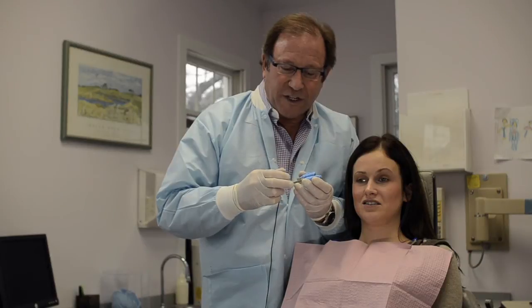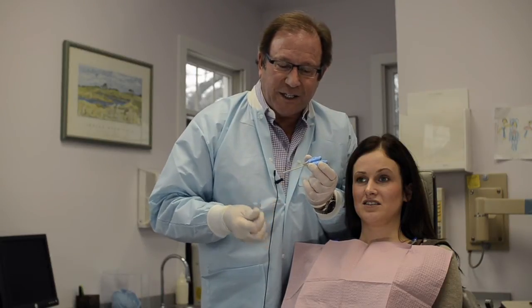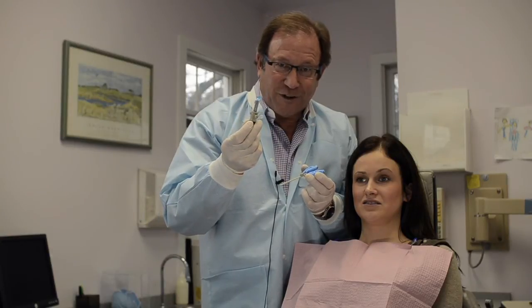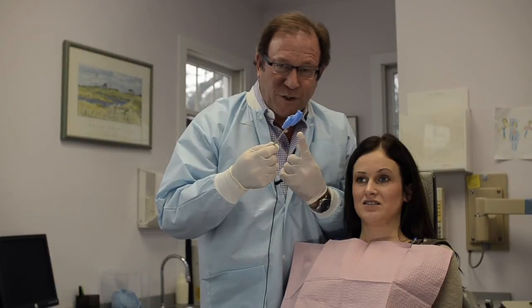After you have the bite record, all you do is unscrew the top screw, remove the bite fork, you keep the George gauge in your office, don't lose it, and you send this little 25-cent bite fork with your registration material to the laboratory.